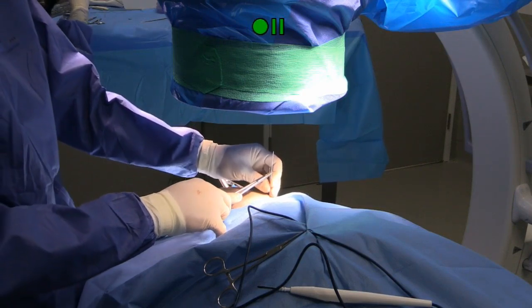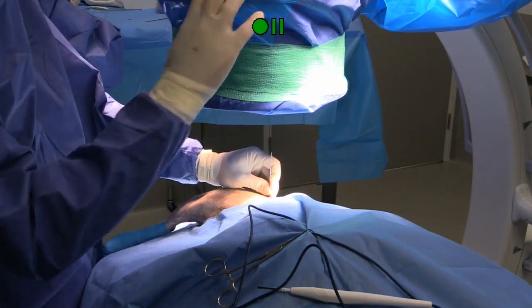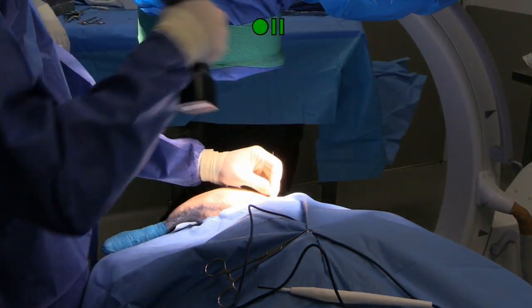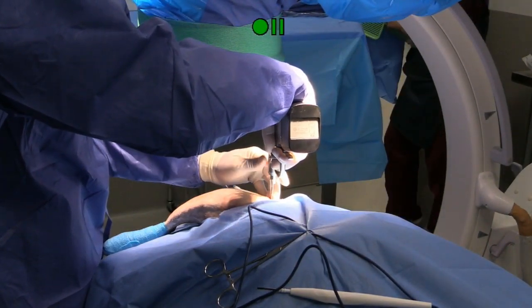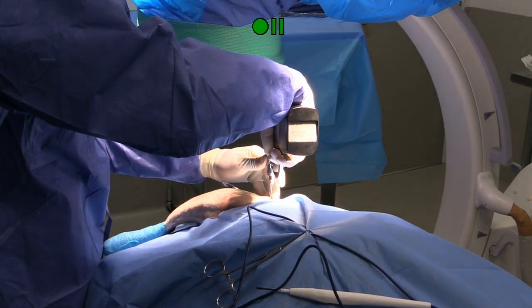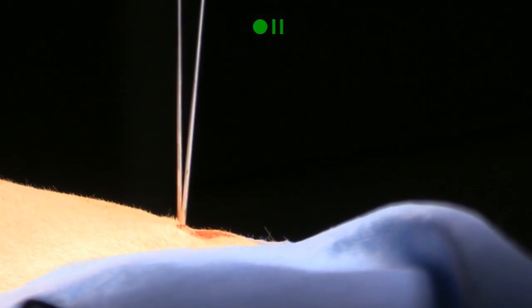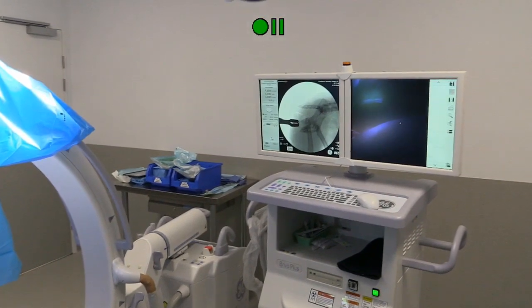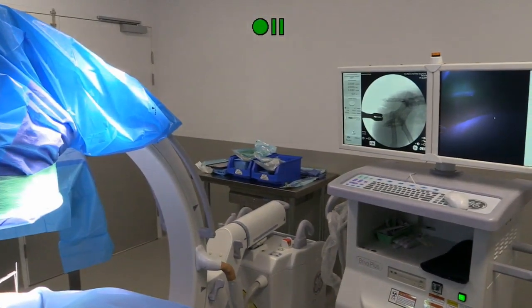There. Just checking that positioning again. Do you need the gantry raised again? No, just slide it out of the way. Okay. Alright, so now we're using a wire driver to drive that pin in exactly on the angle that he had measured before. Before I finish it off, I've just gone through the ilial wing before I go into the sacrum. I'm just going to quadruple check the location of that pin.